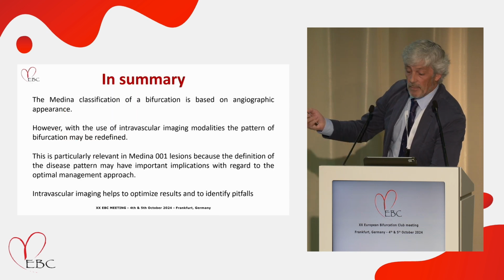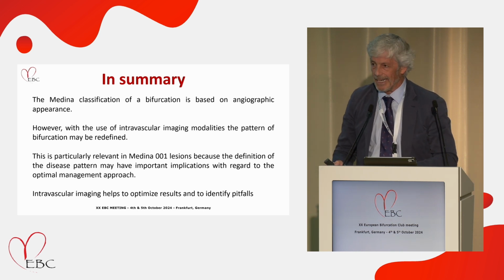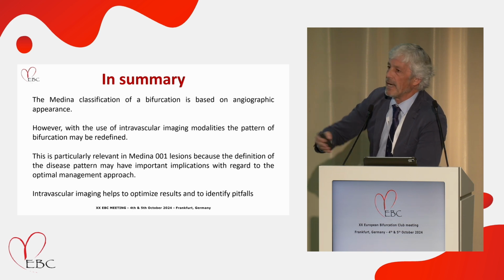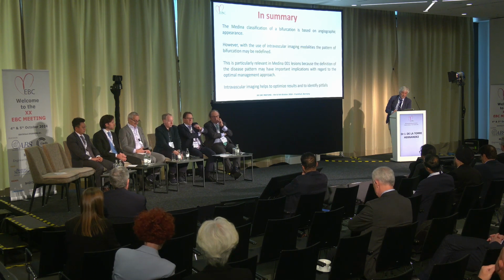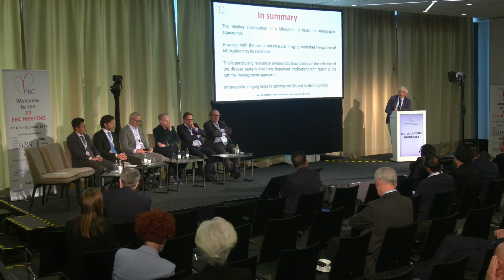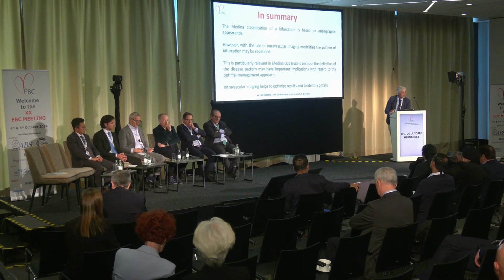In summary, I think the Medina classification is based on angiography, and this is valid, it's true, but intravascular imaging is helpful to redefine the pattern of the disease in these lesions. This is particularly relevant in 001 because the definition of the disease pattern may have important implications with regard to the optimal management approach, and also helps to optimize results and identify pitfalls that could decrease these pretty high MACE rates that were presented, for example, over 13%, 14%.